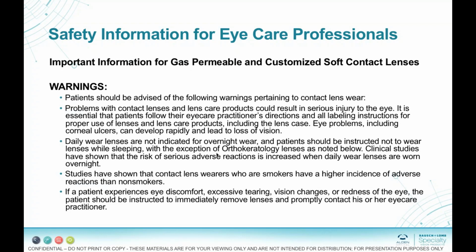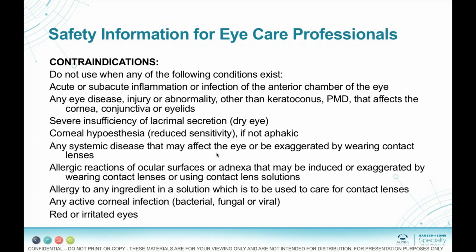So again, it's important that we don't think of the scleral lens as a cure for the condition. I'm just going to fit this person with a scleral and all of their problems will be solved. That's not the case. It's a crucial, vital part of managing ocular surface disease, especially when the vision is reduced. When the vision is reduced and the patient has reduction of quality of vision from their ocular surface disease, a scleral lens is often the best approach to help with the vision as well as their symptoms. But we also cannot forget to manage their dry eye condition for the benefit of their contact lens surface function.